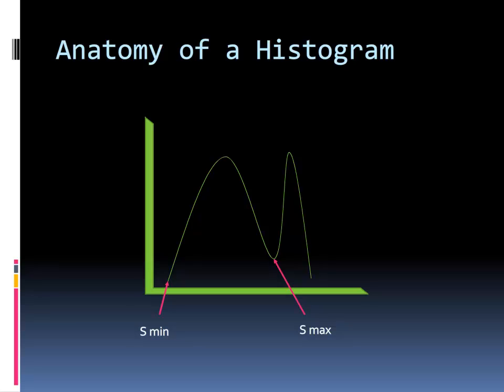The exposure indicator is a numerical value that indicates to the technologist the level of radiation exposure at the image receptor. Technologists can utilize this number in the process of determining if the exposure factors they chose were ideal for that image. There are areas outside the VOI that are included in the histogram that represent pixel values that are not within the anatomy of interest.